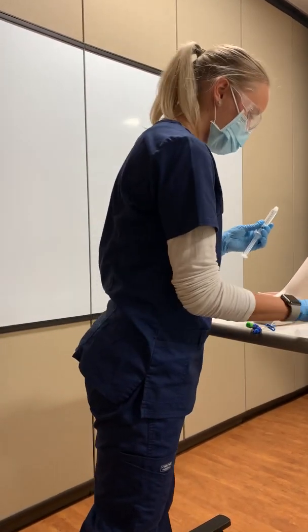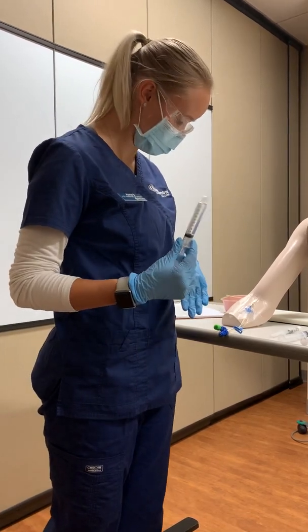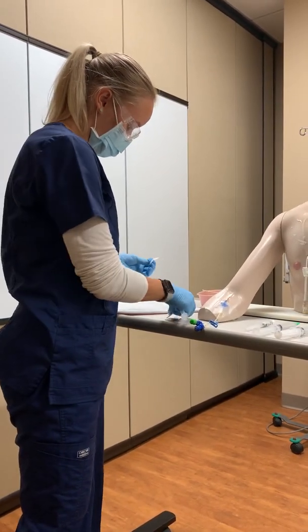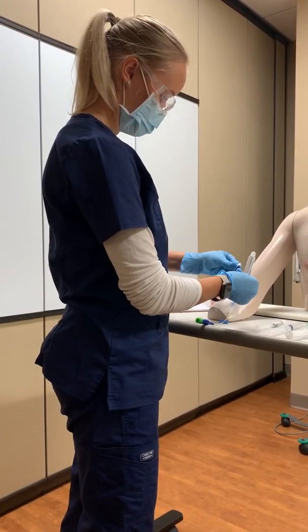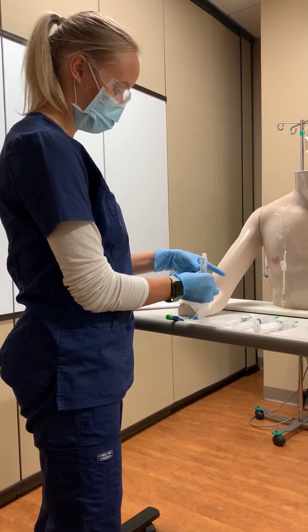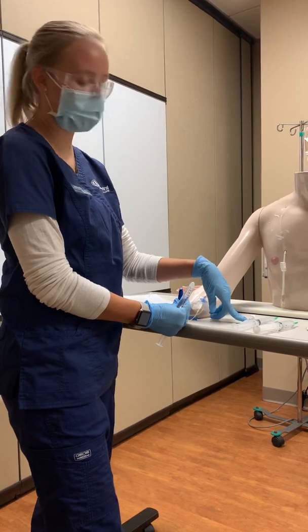I would make sure that all of the air and all the bubbles are out of my syringes, which I don't have any. If she had heparin, I would use an empty syringe and get the heparin out before I injected the normal saline. So I will clean off her port for 15 to 20 seconds with an alcohol swab, depending on agency protocols. And then I would make sure that if she had anything else running, the Zofran was compatible with it.